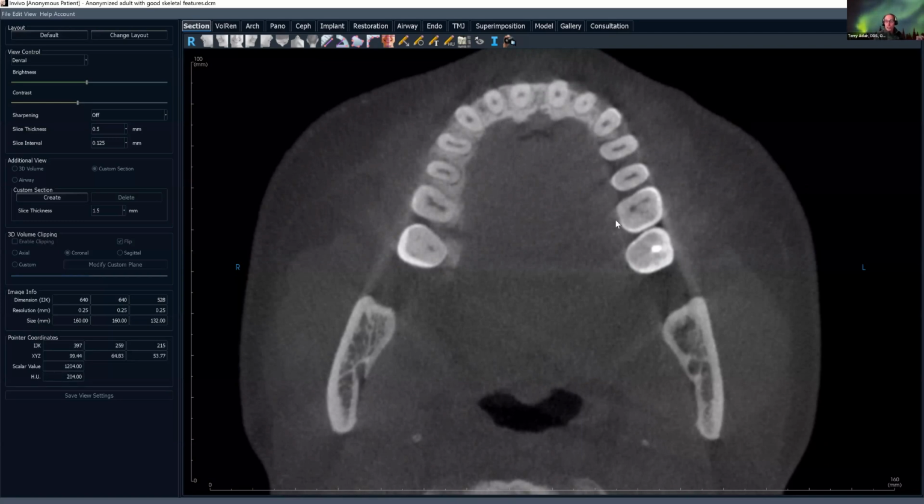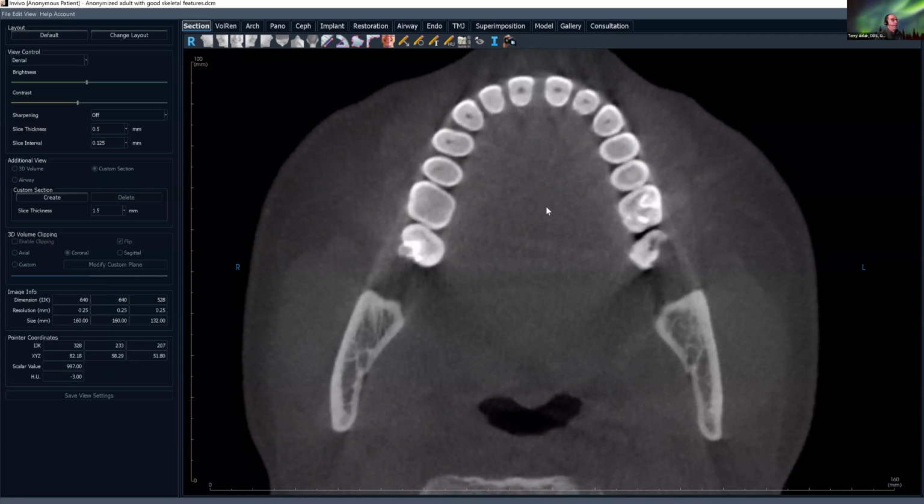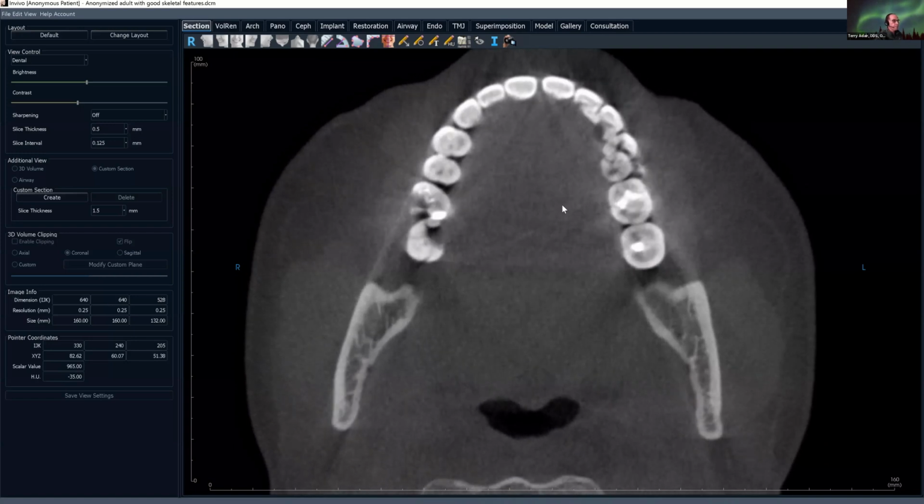And this is important because you almost will never see these early on, at least for sure, in your intraoral images. And so this is an excellent opportunity to look for a fairly common condition. So I want to pause, recount my teeth, relook at it, make sure there's no supernumerary teeth hiding in there. I'm scrolling inferiorly.